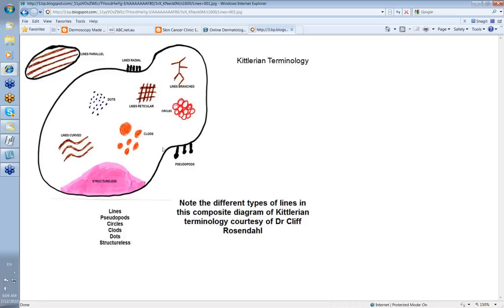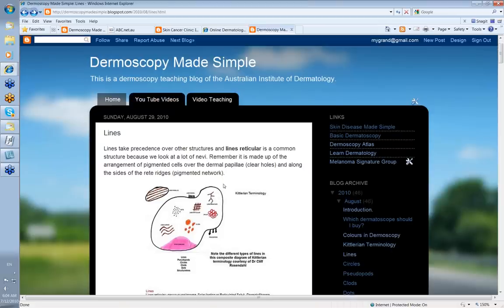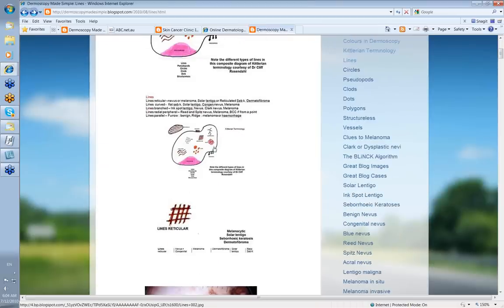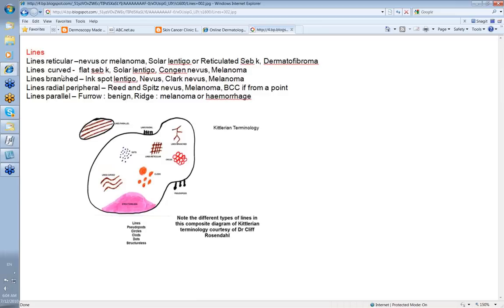Pseudopods are also lines peripheral, but they have a small knob at the end of them and they deserve a different video on their own. Normally the diagnosis of lines reticular is going to be a nevus or a melanoma, a solar lentigo, a reticulated seborrheic keratosis, or a dermatofibroma.